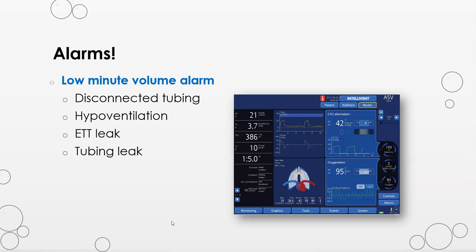A low minute volume alarm is much easier to assess. There is a less than desired tidal volume being delivered. Is the patient hypoventilating when on SIMV and they need setting adjustments? Is there a leak somewhere in the system, or is there a tubing that is disconnected? So low pressure alarms, a lot of times it's a disconnection of tubing.